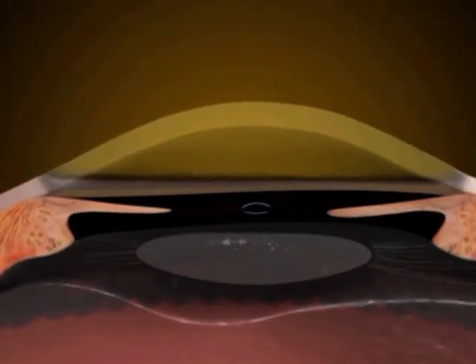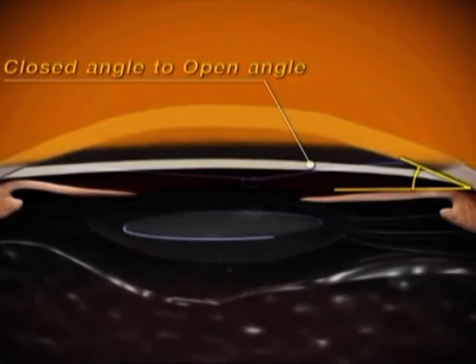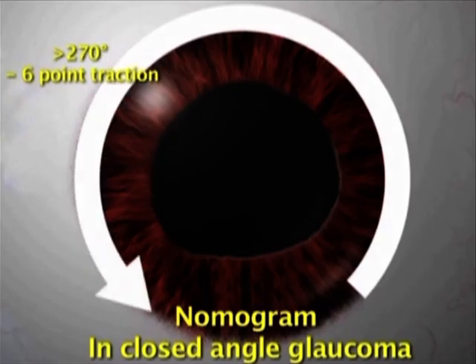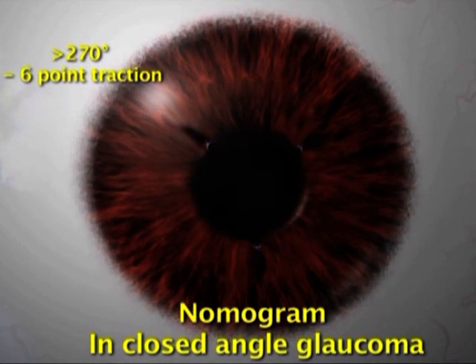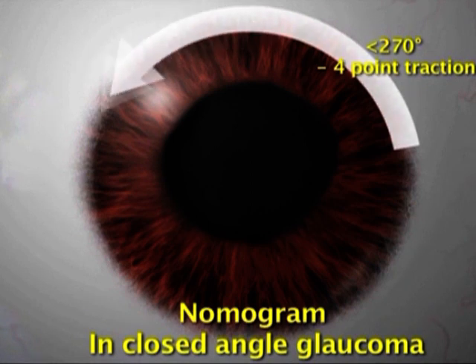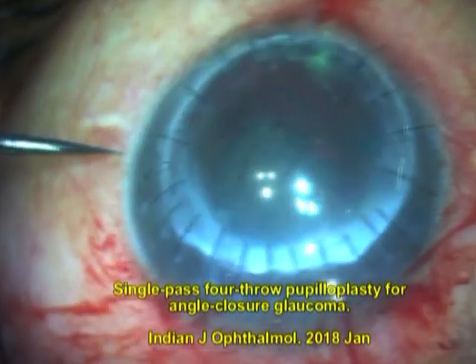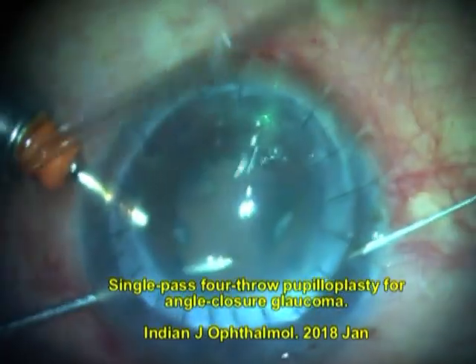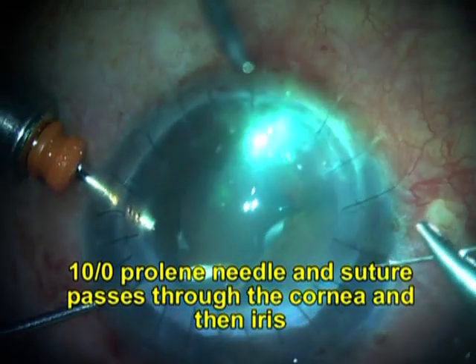We created a nomogram for Urrets Zavalia syndrome. If there is closed angle more than 270 degrees, 6 points traction is done. And if less than 270 degrees, 4 points traction is performed. Anterior chamber can be maintained with viscoelastic or fluid through an AC maintainer or a trocar AC maintainer.